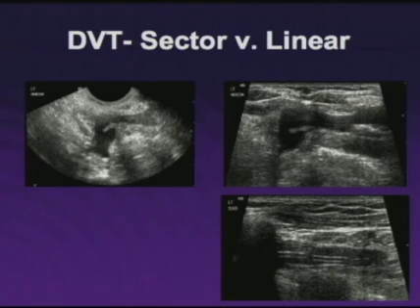You'll note, by the way, that the catheter isn't seen on either of the images above, and that's because unless you hit catheters at the proper angle, because they're specular reflectors, they may not be obvious. And so we do not always follow the catheters, even though we know they're present, and they can't always be seen throughout their entire course, even when we know they're in the vein.